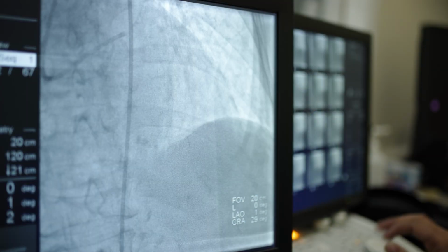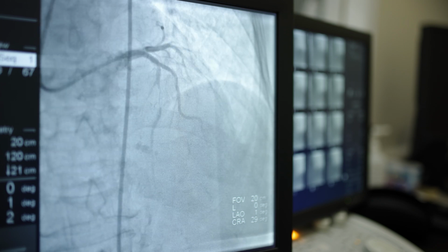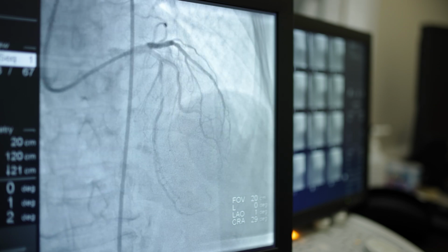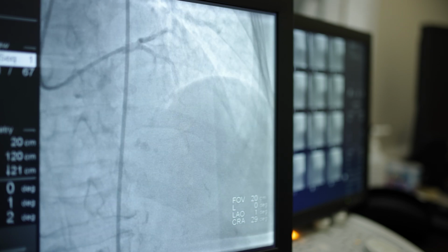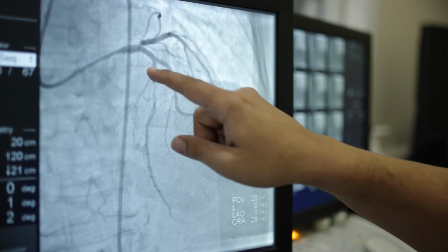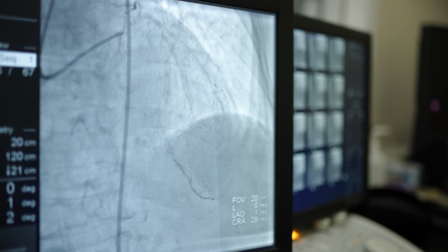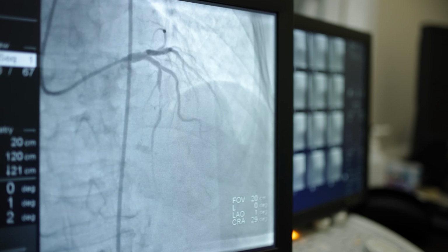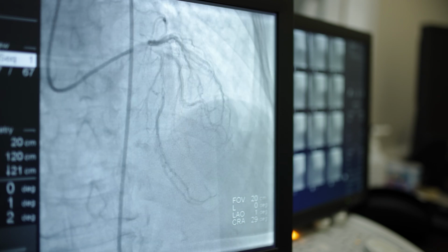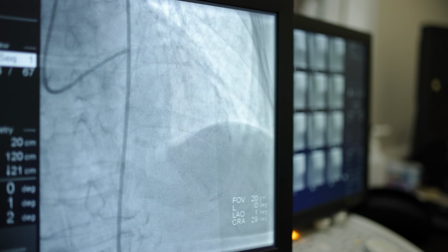So this senior lady we have here today has had unstable angina symptoms back and forth. She had a stent done last year in the diagonal branch, as we can see, but still has a very tight lesion in the mid-LAD that we tried twice to get through with a balloon or other equipment, but it didn't go through because of heavy calcification. So we decided to go for the procedure of rotablation.